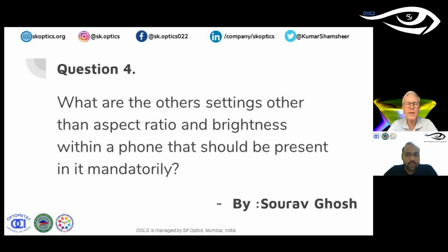No, I really can't think of any. Other than, remember I showed you a screenshot of a program to change the settings of your phone. The most useful thing about that is the exposure. So as you're looking at the picture, if you can adjust the exposure, that is very, very helpful. Exposure is different than the light settings of your slit lamp. So I think that would be useful.